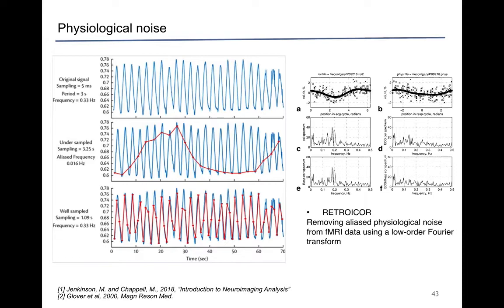The original time series had many cycles here, I don't know how many, maybe 20, whereas what I sampled looks like one cycle. So this is called aliasing, meaning that some high frequency effect is mapped to very low frequency because of undersampling. But if we sample fast enough, then this aliasing issue will not happen. If you look at the third row, if you sample at least 2 samples per cycle, then you're okay.